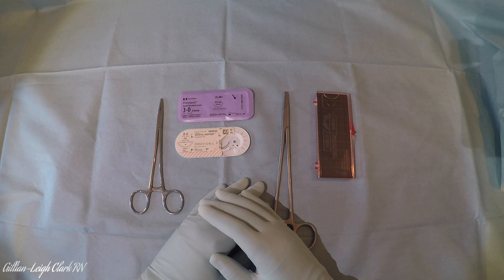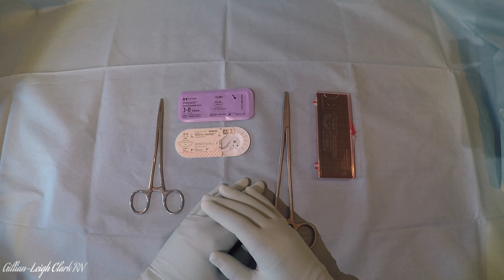Mounting sutures onto needle holders needn't be difficult. It can seem a little daunting at first but it just takes a little bit of practice. Obviously we're looking for safety, speed and accuracy, so when in the middle of surgery you're not wasting time faffing about repositioning your needle on its needle holder.